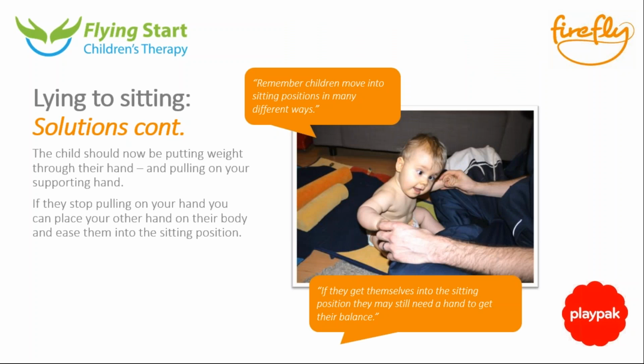Yeah. So he just needed that little bit of help here to then straighten up. He was a little bit wonky, falling over, so I just gave my left hand to his right so that he could then straighten himself up. But they should be then putting weight through their pelvis nicely, but they would still be unsteady because there's no support here. But you can try as you can to take your hand away from theirs. You could also take your hands between their legs so that it's then taking them forwards and propping through their own hands so they're a little bit more stable.